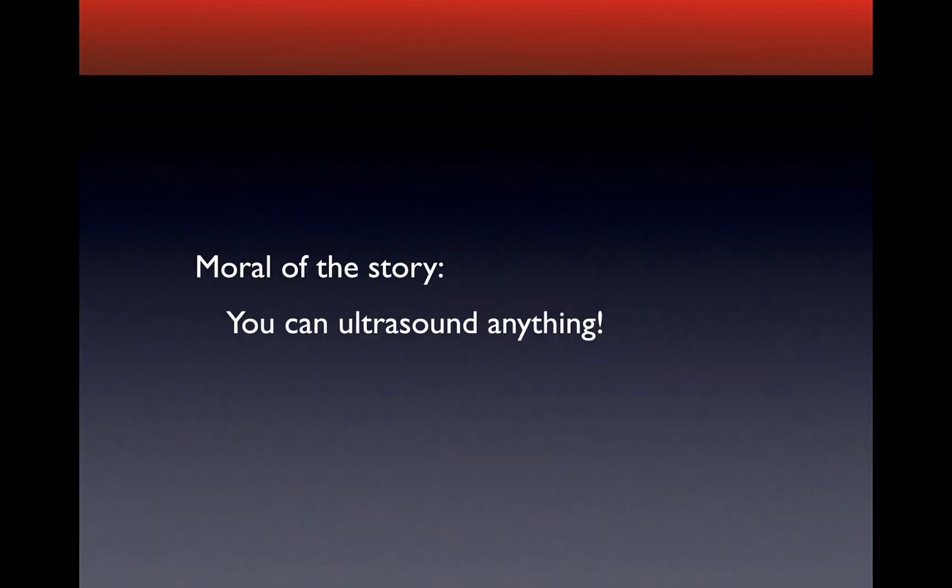So the moral of the story is you can ultrasound anything, or at least try. If you run into any problems, remember this is not one of the typical places we're ultrasounding around, so you always have availability of confirmatory studies or applying your clinical story.